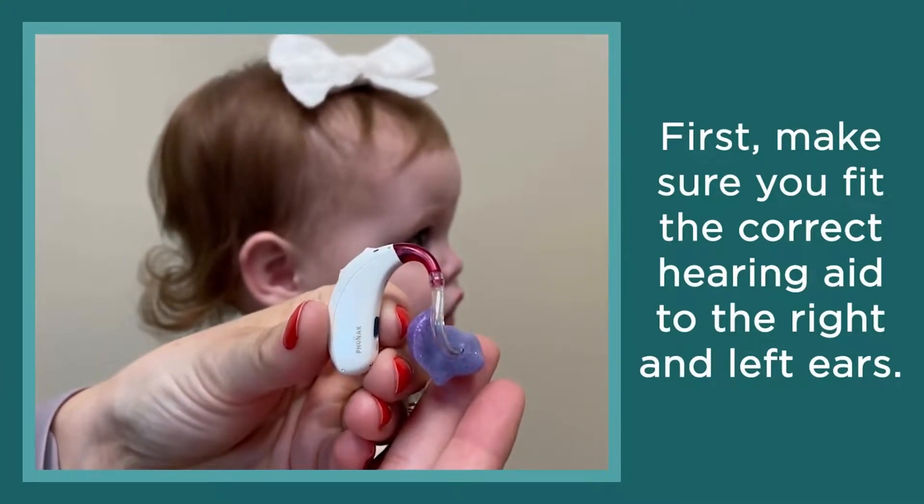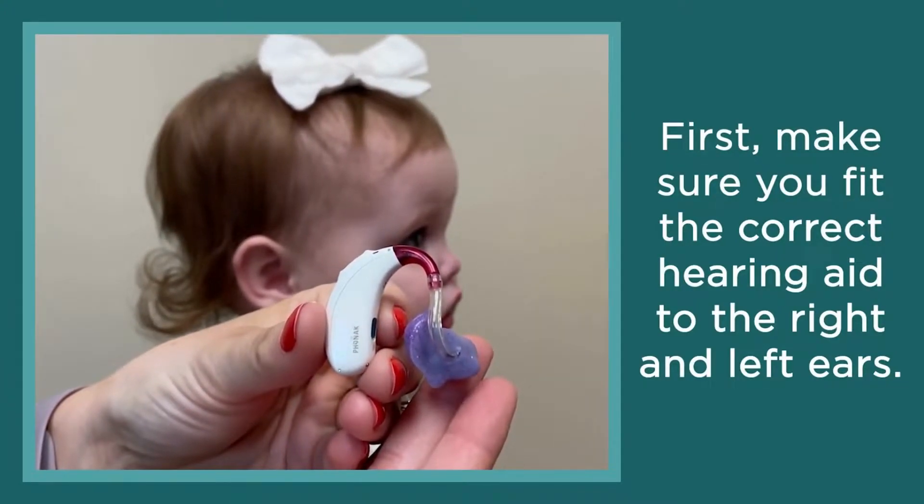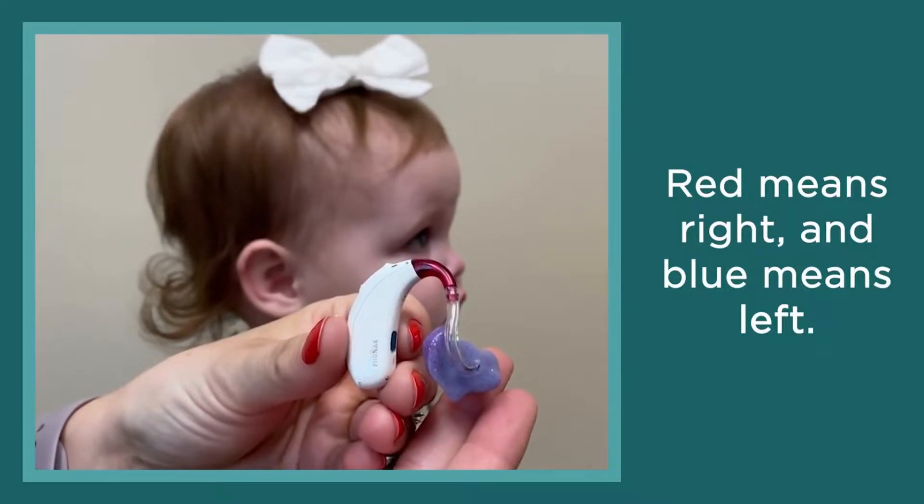First, make sure you fit the correct hearing aid to the right and left ears. Red means right and blue means left.